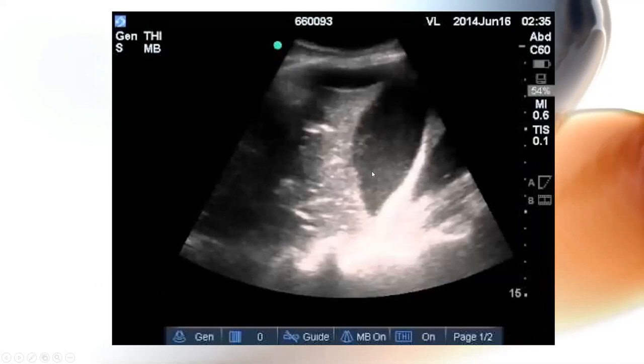Just more, this is a really good one. Simple or complicated? I did fail to teach you complicado. Could be. I failed to teach you, and this only happens when I forget, because I thought I had lots of slides. We talked about depth, how deep you can see. You can change the depth, you can make it less deep or more deep. What I didn't talk to you about is gain. And I don't know how I forgot about gain, but forgive me.